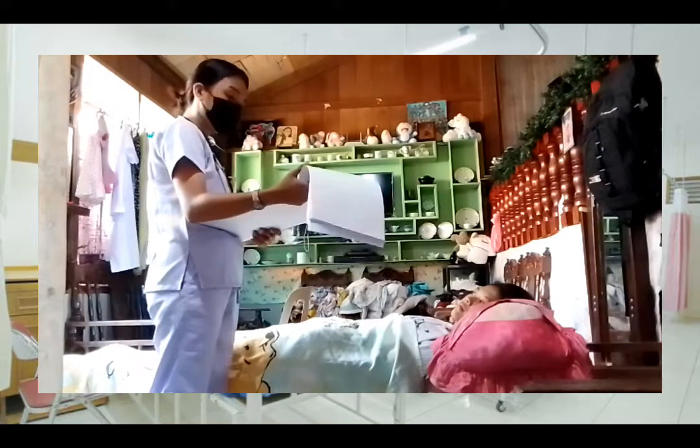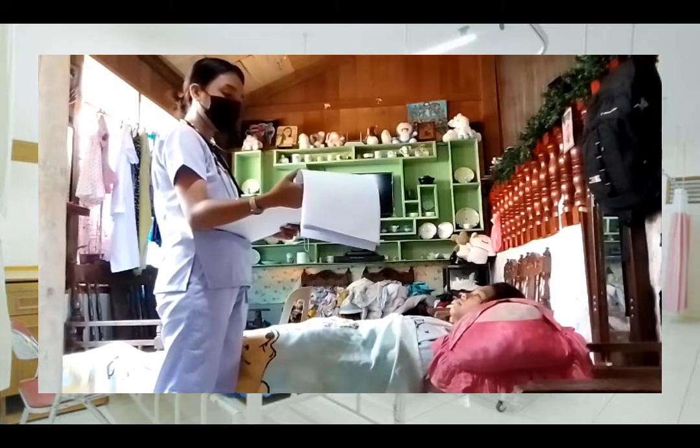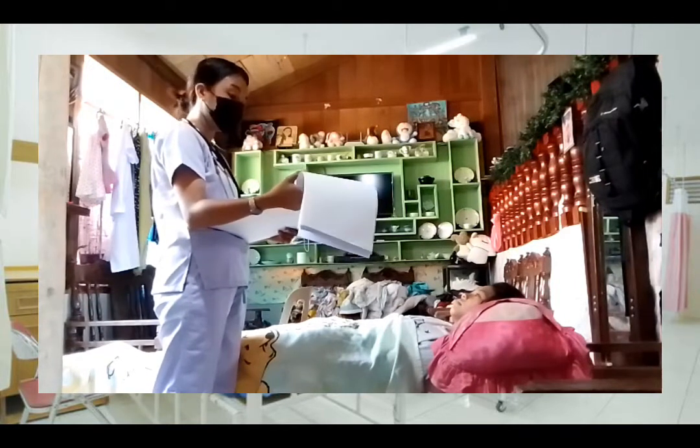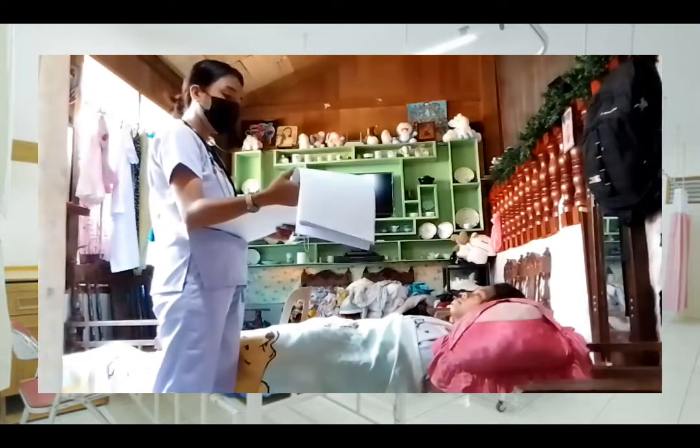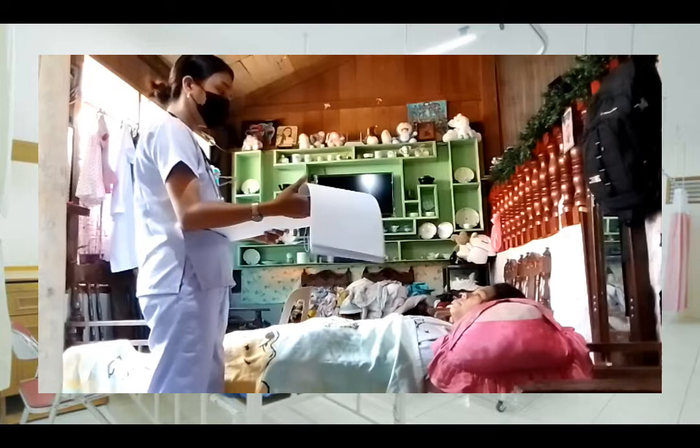Hi, Miss Lejero. I am your student nurse today, and I am going to take care of you. I am here to collect this specimen to identify why you have a problem in your urine. Okay, ma'am?